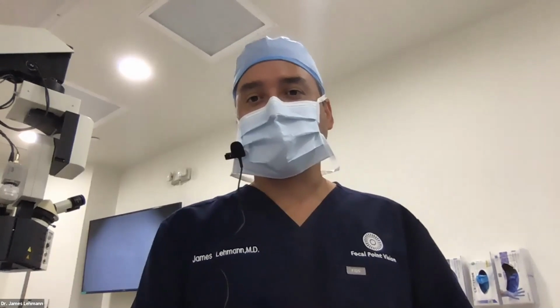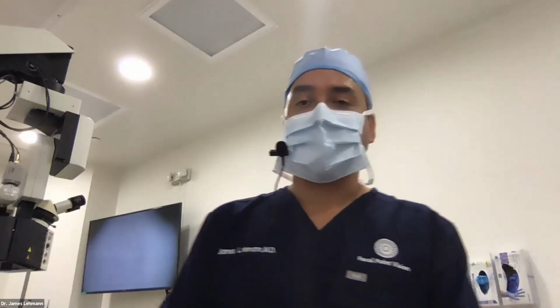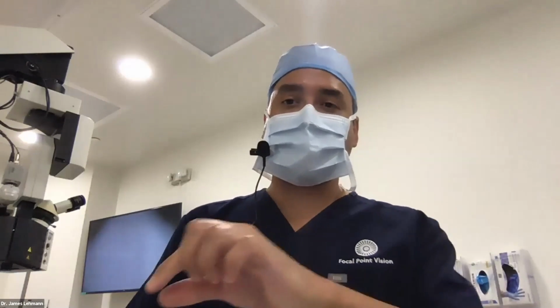Dr. Agua asks, is this a Technis IOL? Yes, it was a ZCB00. Dr. Walid asks, can we enlarge the capsular rhexis if we made it small? Yes, but it's tricky. You have to make a little nick into it and then rotate it around again.